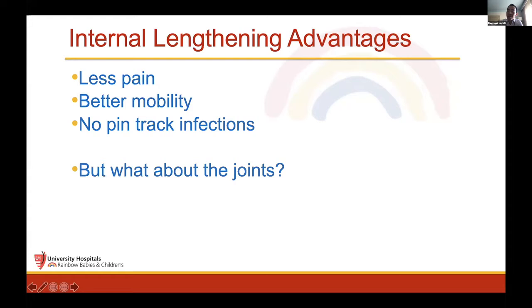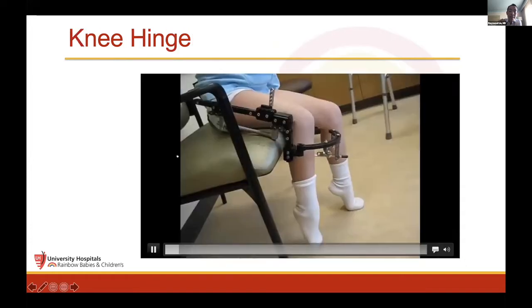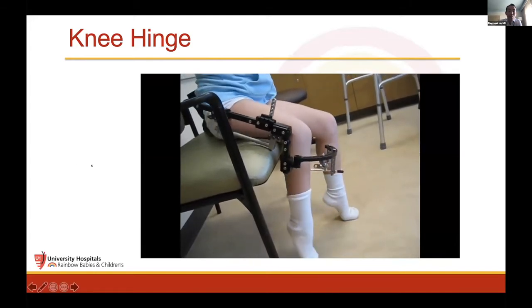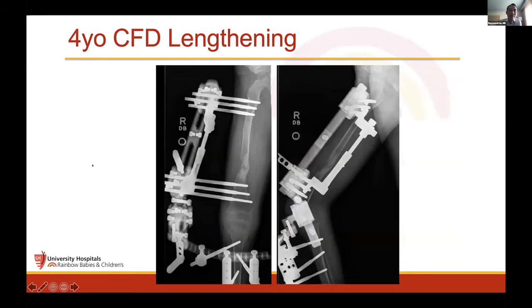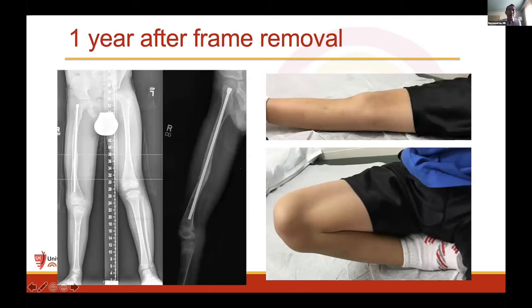We're lengthening the bone, the muscles get tight, and the joints are at risk. And so when you do external fixator-based lengthening, like in someone with congenital femoral deficiency here, you can see there's a hinge going across the knee to protect the knee. And if these are well placed, then they can have fairly good motion with these on. And we just feel a lot more assured that we have protection there. Even in this kid who was undergoing this lengthening and had some posterior subluxation of their tibia, despite that protective hinge being there, you can take them to the OR and you can correct them acutely and keep that hinge on to keep them in place and feel some confidence that they're going to have a reasonable amount of motion in the future. So this is him a year out with good motion of his knee.